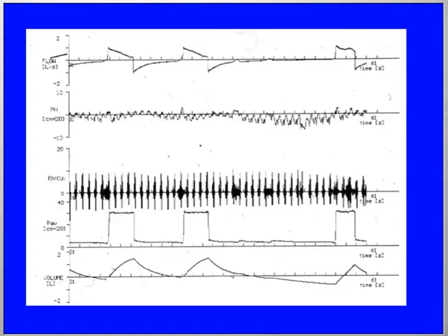One is the occurrence of apnea. You see patients who are not breathing for 10, 15, 30, 45 seconds, and usually you have alarm on the ventilator. And this has been shown to be a big problem at night during sleep because it can wake up the patient, at least interrupt sleep.